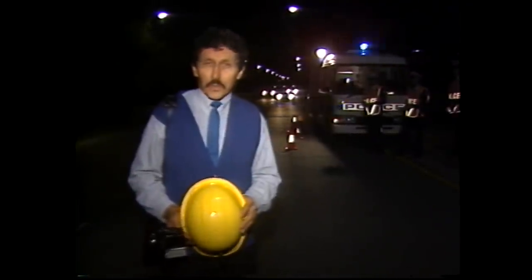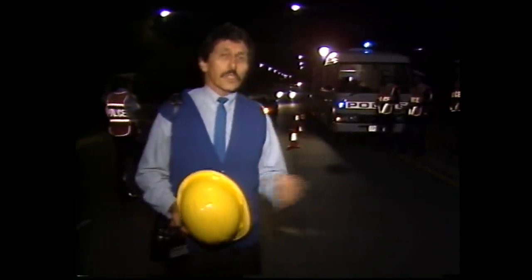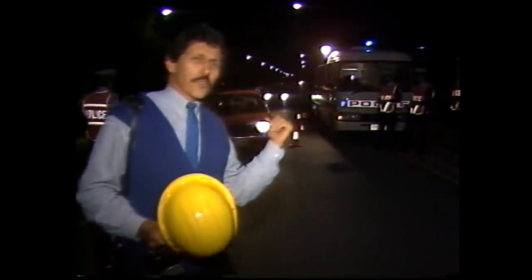Have you ever wondered how a breath testing station works? We're here in a city street tonight with 10 police officers. They'll be stopping about 600 people. They're about to flag someone down. Let's get the head cam on and see what happens.